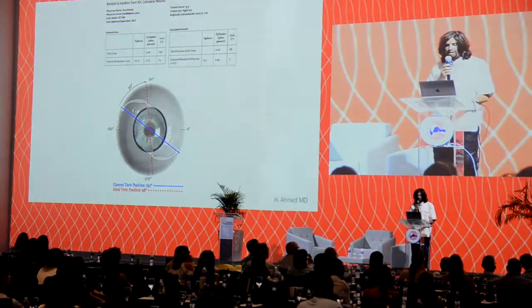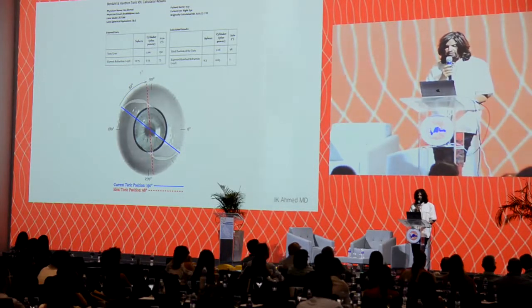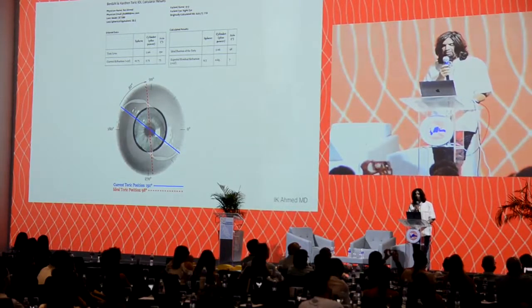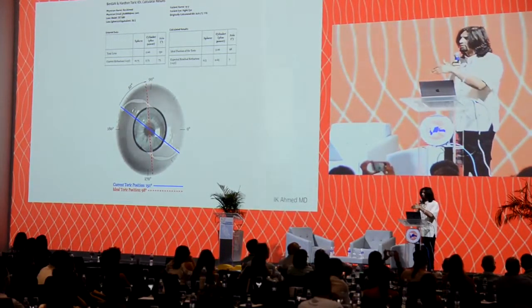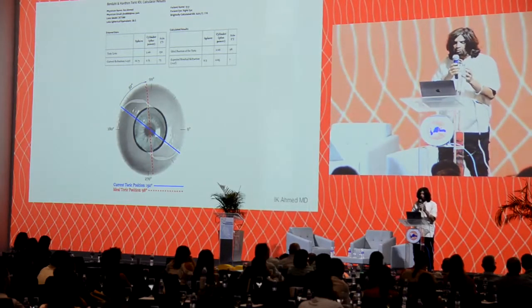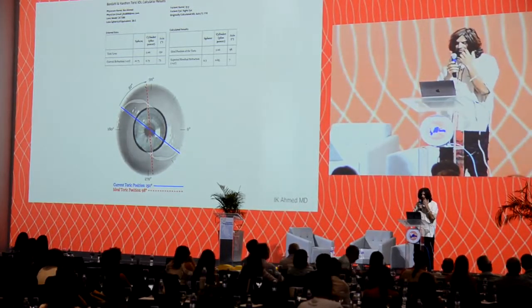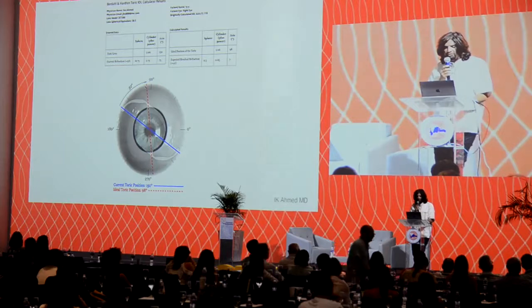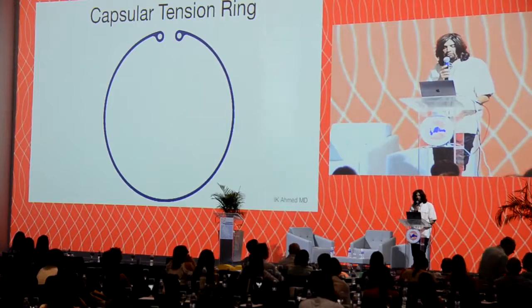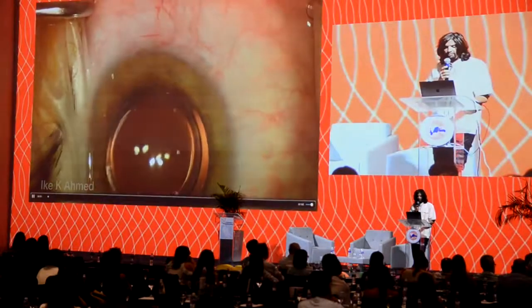Another example, patient here has a residual cylinder of 2.75 diopters. The lens is sitting at 150 degrees, but the ideal position should be 98. Now you may say, why not just put the lens back to where you put it originally? Well, remember though, the refraction may have changed based on the surgically induced astigmatism, so always run some sort of refractive divergence formula using astigmatismfix.com to do that. We often do put a capsular tension ring in as well, because we feel the CTR may expand the capsular bag and may perhaps prevent rotation.